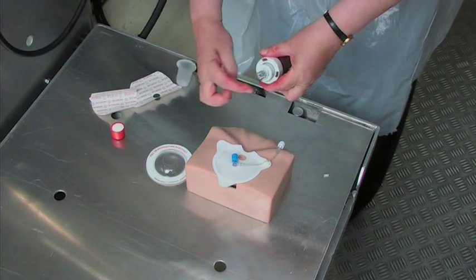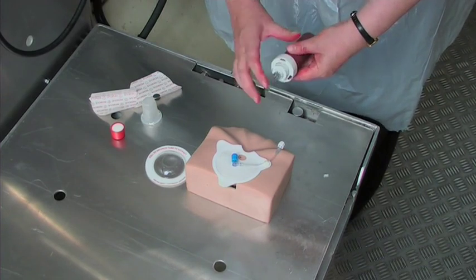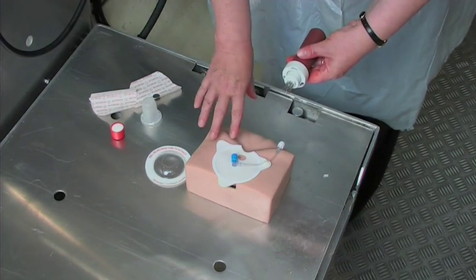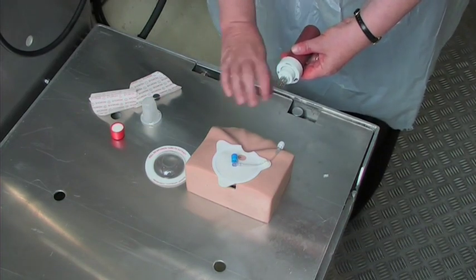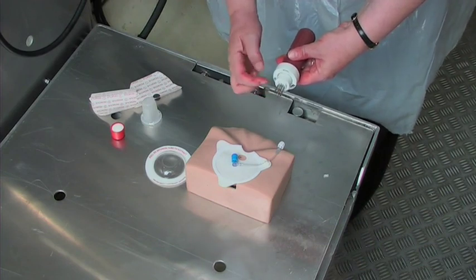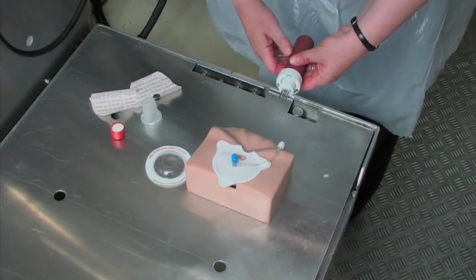Okay, although this is a fairly frightening looking instrument, these needles round the outside don't go into the patient at all. These are there purely to make sure, A, that there's good purchase. Often if it's trauma and there's a lot of blood, the skin can be quite slippy. And the other thing is also, it will only fire if there is equal pressure on all of the needles. That prevents any misfiring and any operator injury.